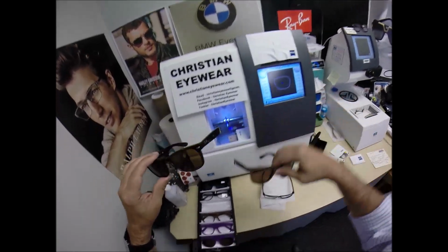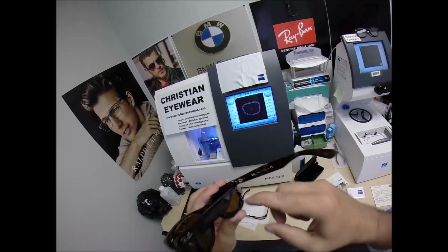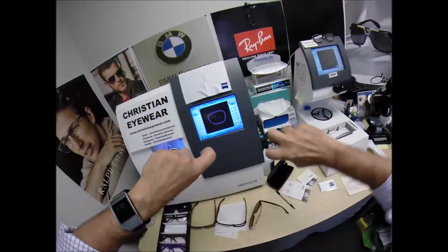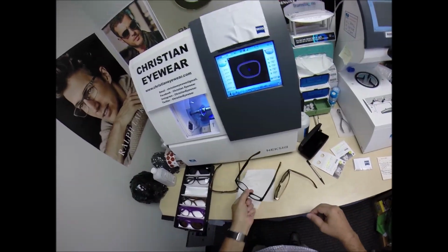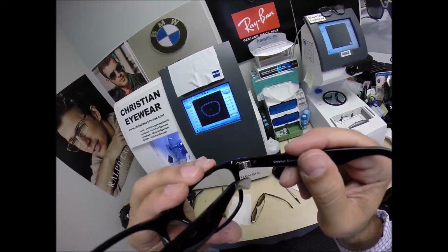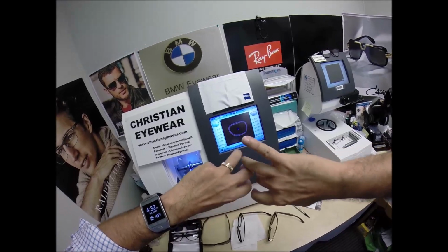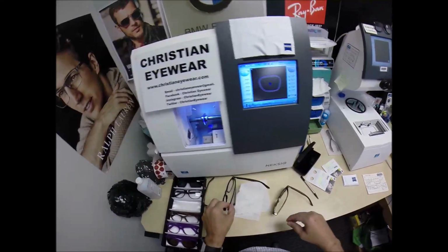Now the one thing I did do, this has what's known as a 3-barrel hinge. There's 2 barrels on the actual temple. There's 1 on the frame front. This is the frame front. These 2 go here, the screw goes in, and that's the 3 pieces. The one thing I wanted to do for my collection is I put a 7-barrel hinge on there. I wanted these to be as strong as all get out. So 4 here, 3 here before the screw goes in, and that's what's going to make it nice and strong.